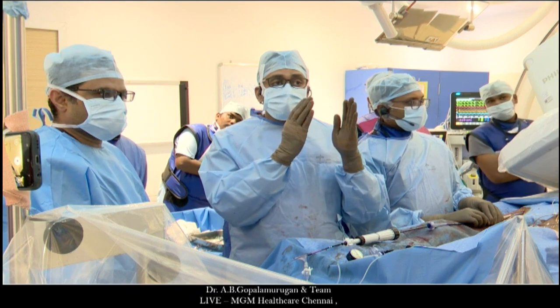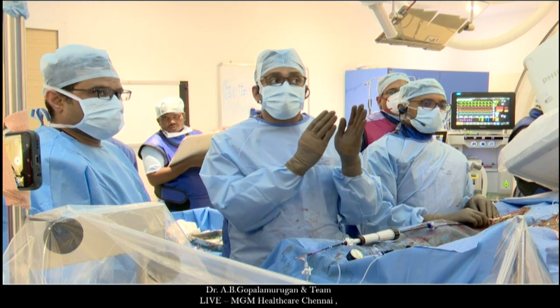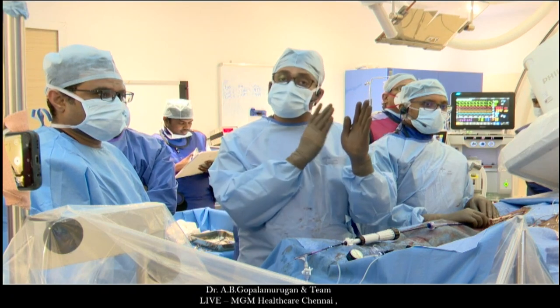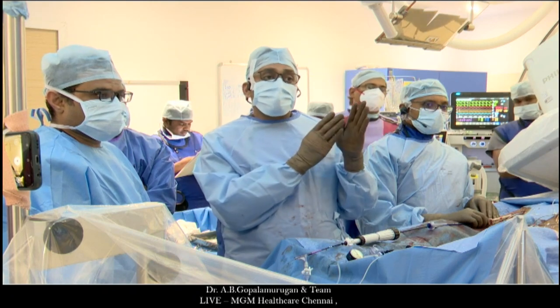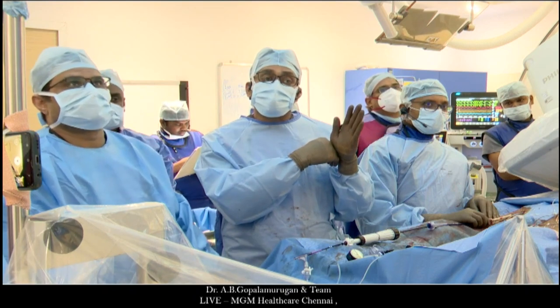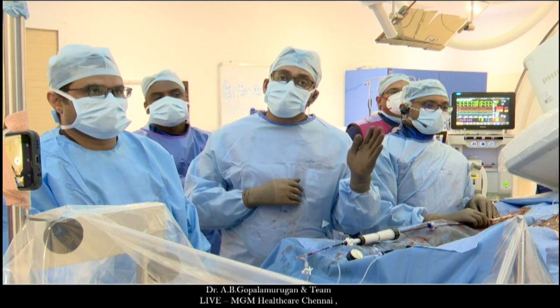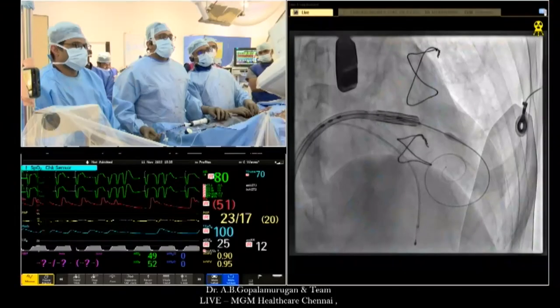Keep it somewhere 70-30 and be prepared to push forward, because what you don't want is to aim for a perfect landing zone and then end up in embolization. You'd rather get less than perfect but no embolization, because that's the worst case. Of course, you don't want it too atrial, because then you're going to have an in-out mitral regurgitation. That's a disaster too. The more atrial metal you have, the higher the risk of valve failure and valve thrombosis. So it's a balance. Gopal, you have a question from Dr. Anand. No, you carry on.